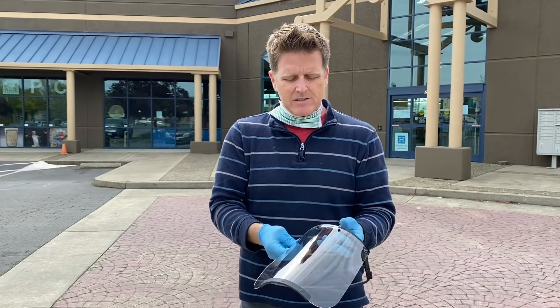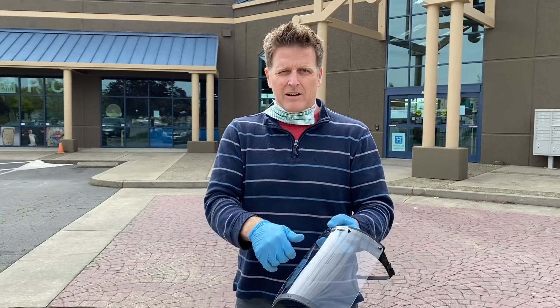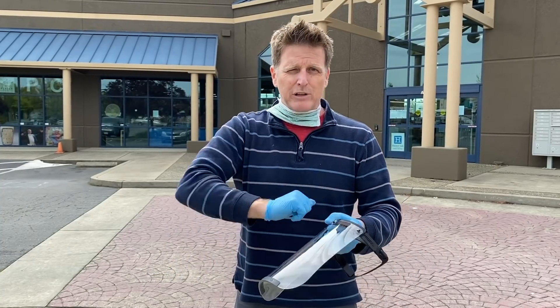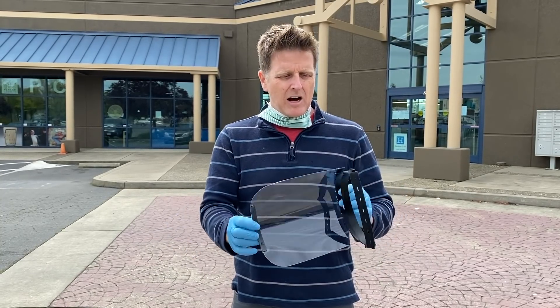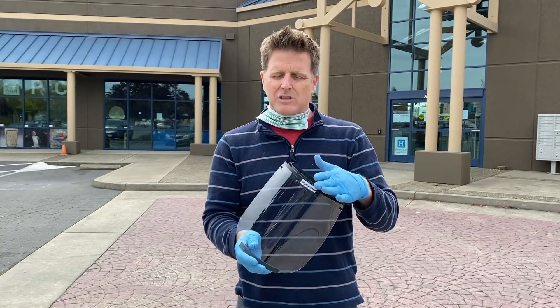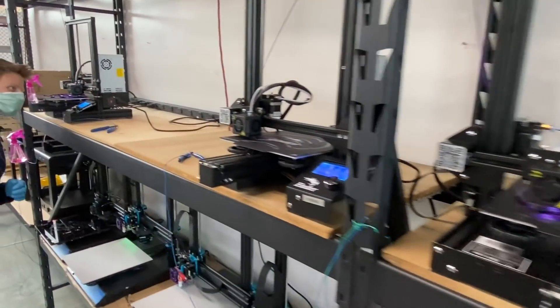We're sending them out — one is assembled in a box — we're doing 10-packs and 50-packs. They get a demo one, but the rest are flat-packed so the doctor can assemble it on-site. They can bleach-wipe it, make sure it's disinfected and safe, peel off the plastic from the lens. It's an elegant design.